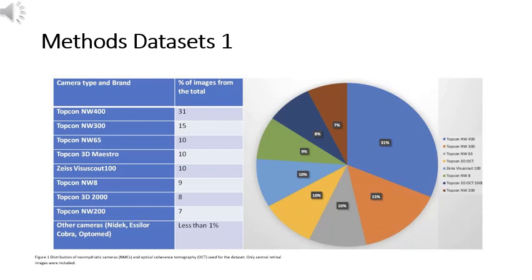The dataset is real-life, not from clinical trials, and anonymized, composed of approximately 80% cases of normal retinas and 20% abnormal ones. Images are acquired using color fundus, red-free, and optical coherence tomography, OCT. The dataset includes images from different types and brands of cameras. Figure 1 shows the distribution of the different cameras used, by percentage.